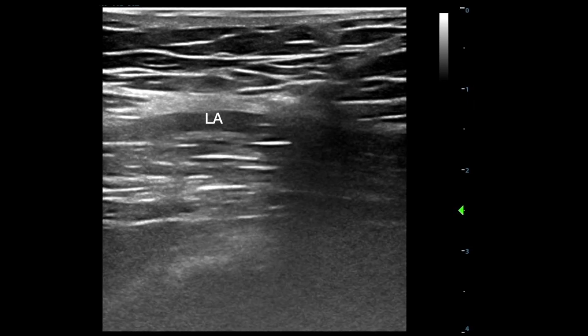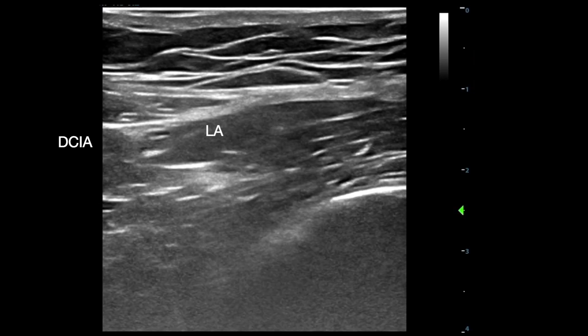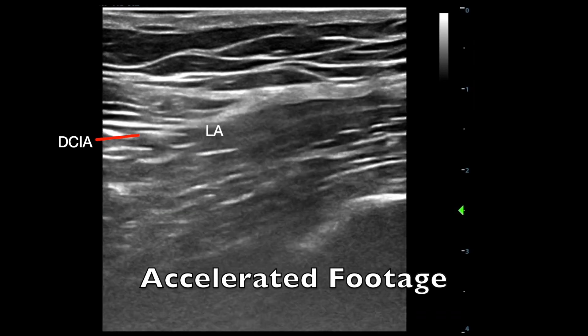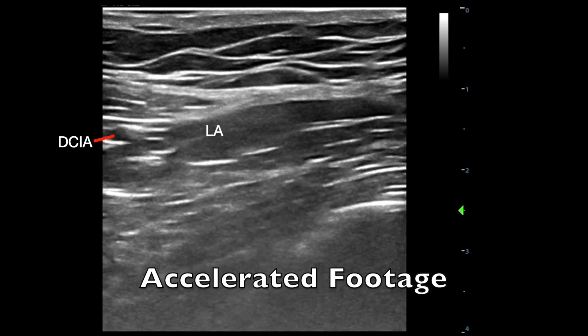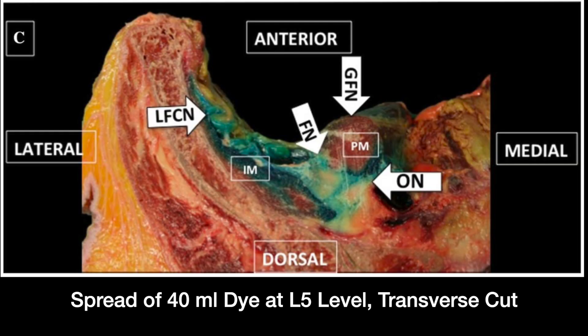Local anesthetic is subsequently deposited into the fascia iliaca compartment. The probe is slid back cranially to demonstrate local anesthetic deposition deep to the deep circumflex iliac artery. To reliably block all three nerves, especially in their proximal course, it is recommended to use a volume of at least 40mL. In this case, we have injected 40mL of 0.375% ropivacaine.